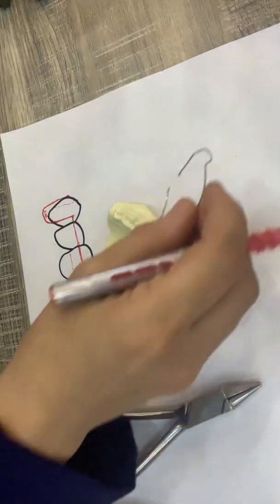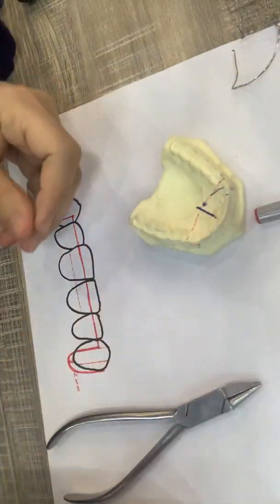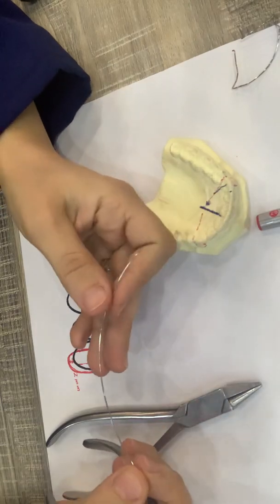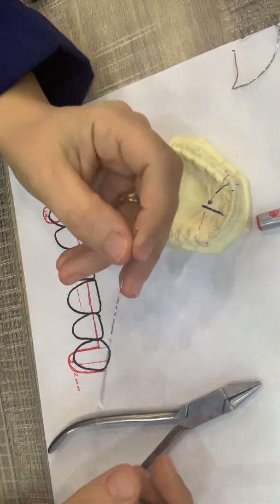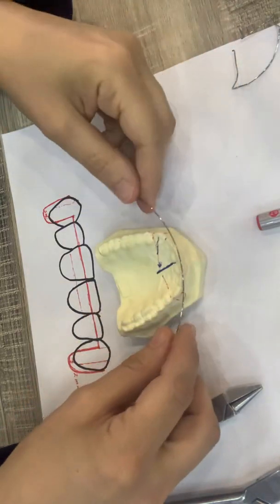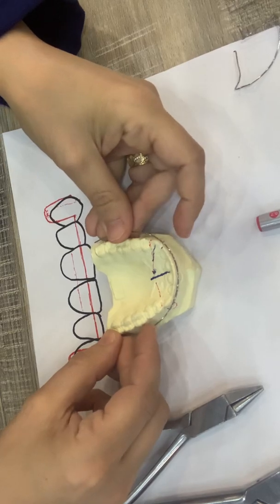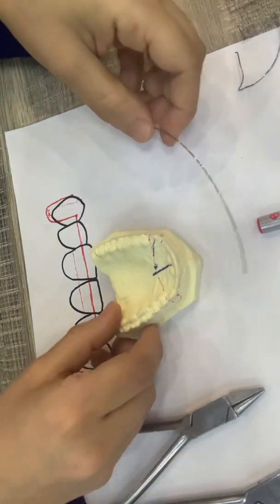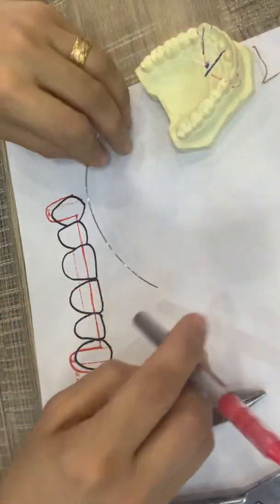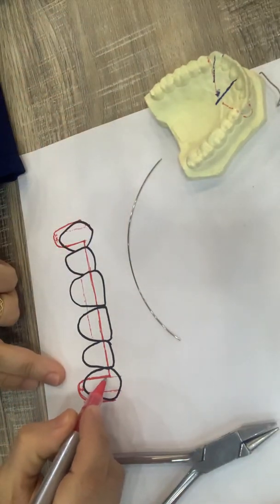Okay, to construct a Hawley arch we need a 0.7 hard stainless steel wire. Its length should be equal to the whole upper arch. First, we draw lines on the cast.